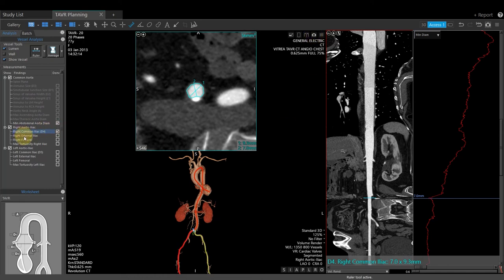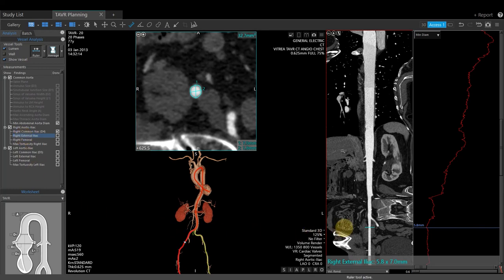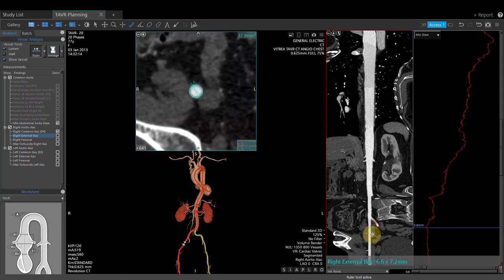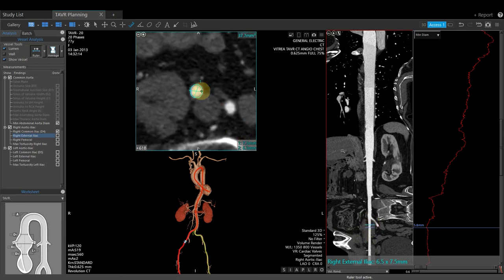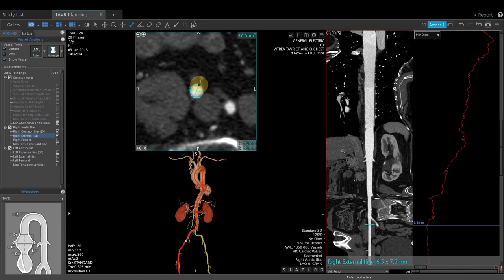Next is the right external iliac. Left-click to select. The software has automatically created this measurement — evaluate and edit by clicking and dragging if needed. Also edit in the short axis view if needed. Note it is not necessary to edit the vessel contour; the important part is the maximum and minimum. Hover over the start or end point of the ruler tool to edit. Note: if the measurement is already locked in by clicking the check box, you cannot edit it — uncheck the box, click and drag, then click Done to lock it in again. Save by clicking the snapshot.